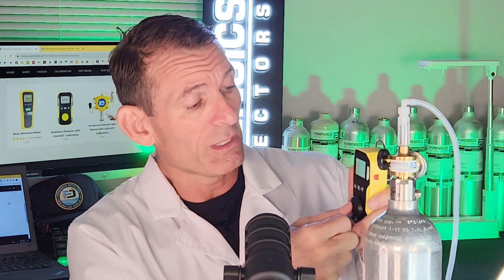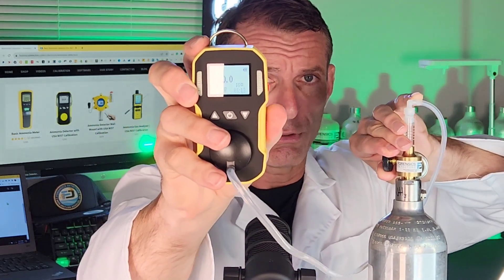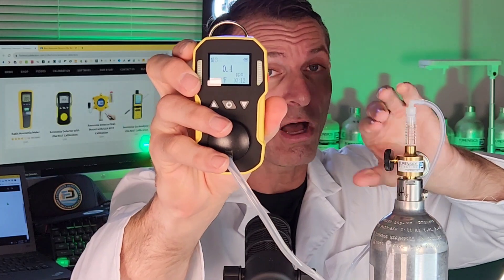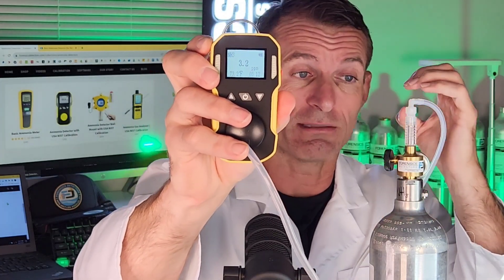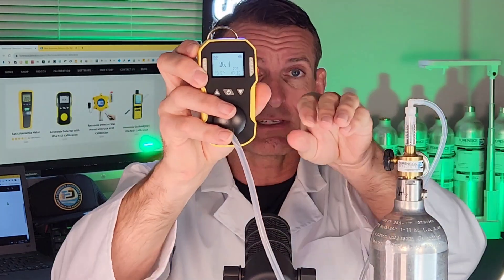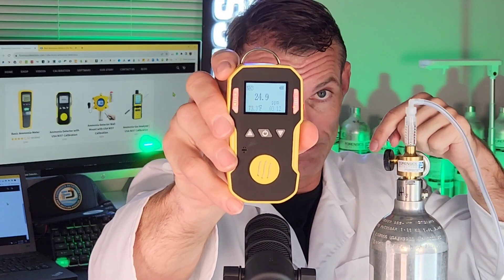I'm just going to give you a quick demo. What we do is we plug up the calibration cap — this cap comes with the package that you purchase — and we're going to expose it to some ammonia gas. You're going to see the numbers going up and get a live demo of the alarms. It's going to soon be alarming, buzzing, and vibrating. Now we're going to turn off the gas. You saw that speed response and the numbers are now going down.